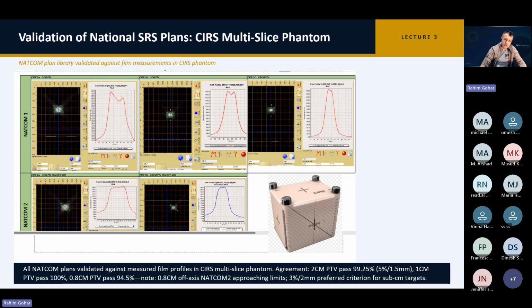We have a certain limit we can accept for the shift, because really it can optimize. Bigger shifts are not a good sign; your setup is not good. So we do check the profiles and overlapping, and you can see for such small field sizes how beautifully these profiles are overlapping, and it can generate the reports.